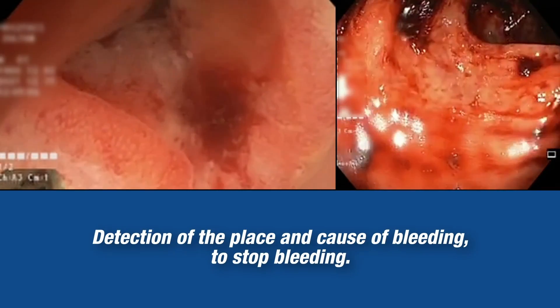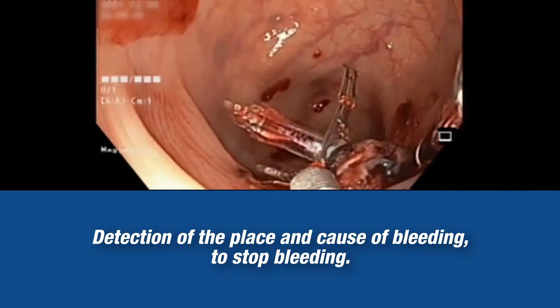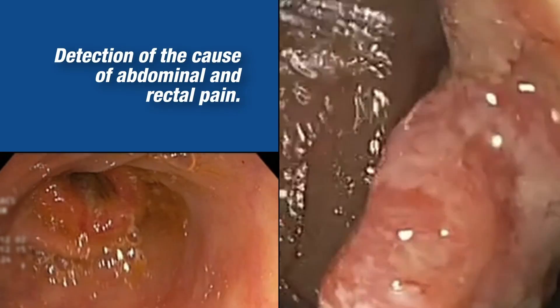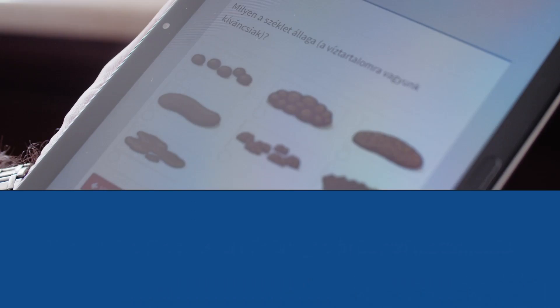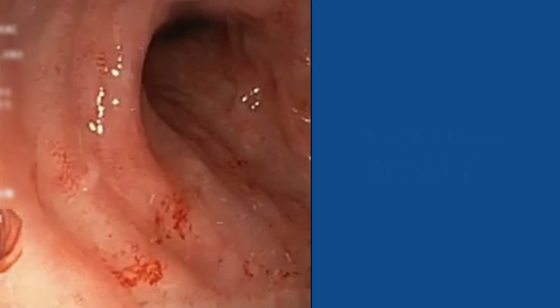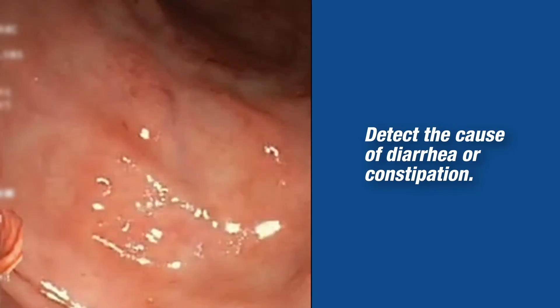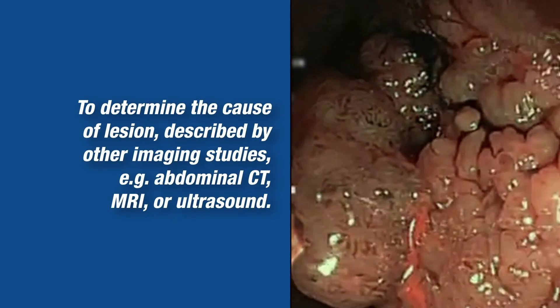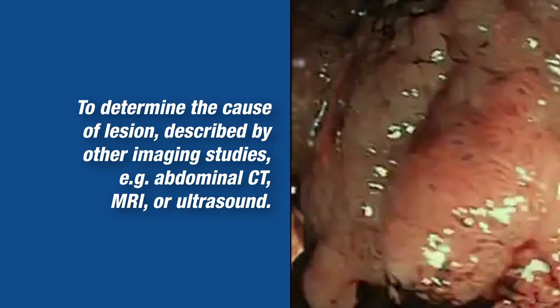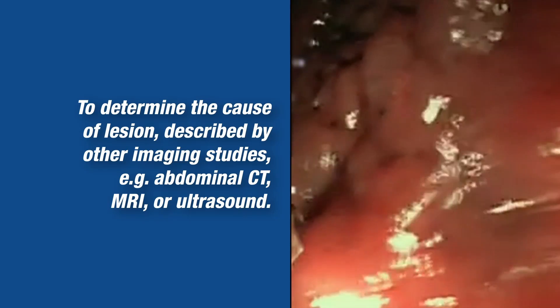Indications for colonoscopy include: detection of the place and cause of bleeding and to stop bleeding; detection of the cause of abdominal and rectal pain; to examine the reason for changes in bowel movements; to detect the cause of diarrhea or constipation; and to determine the cause of lesions described by other imaging studies such as abdominal computed tomography, MRI, or ultrasound.